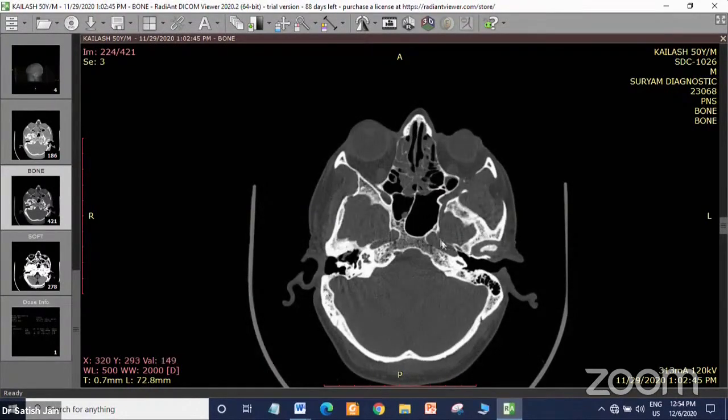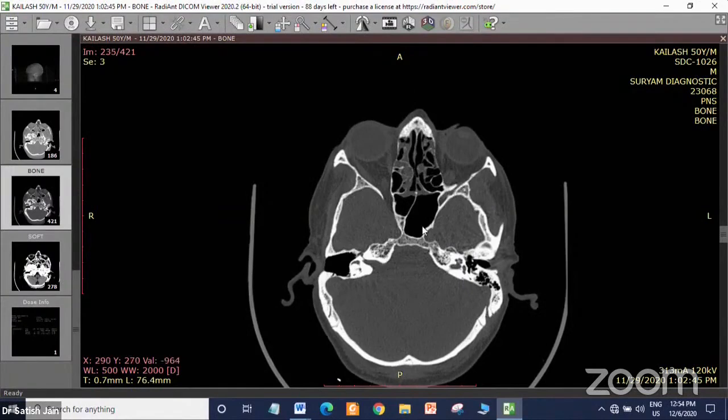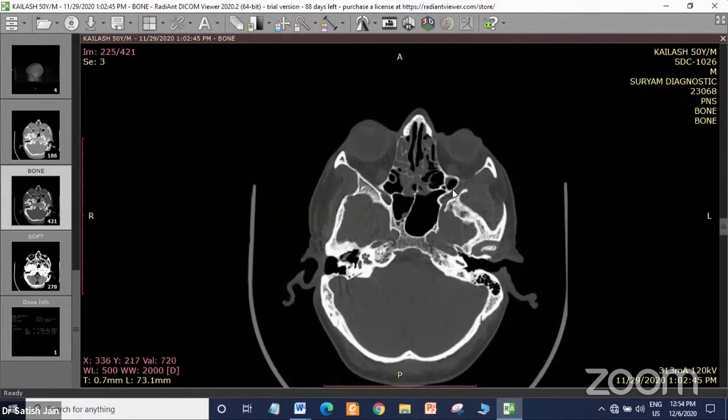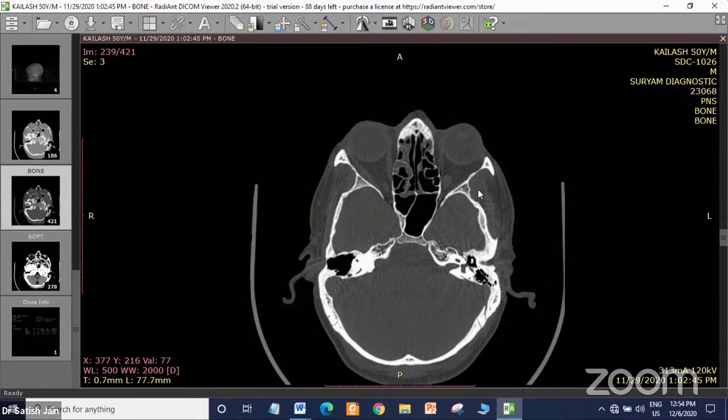This is the carotid artery. This is the prominence of the carotid on both sides. So radiology, you can ask me anything. I'm not going into detail myself. These were the fine points I touched upon. Any questions so far so that we can go ahead with the case? No, please go ahead with the case, sir. Okay, sir.